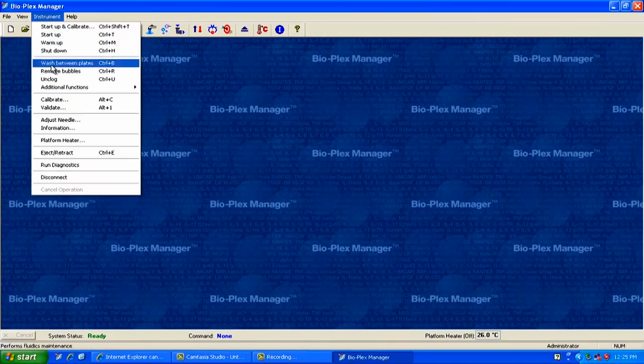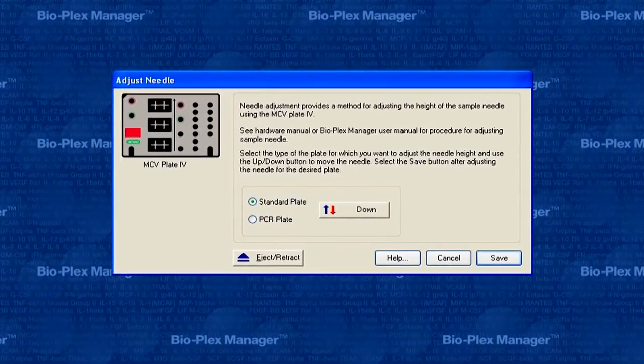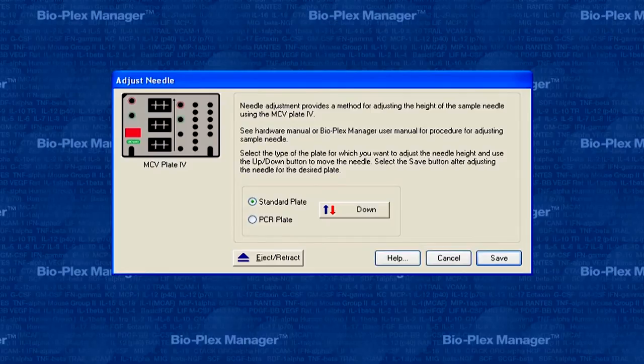Now, click Instrument in the menu bar of the software and choose Adjust Needle from the drop-down menu. The Adjust Needle dialog box will appear.